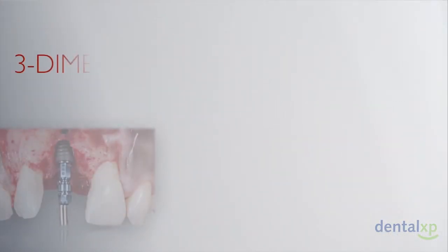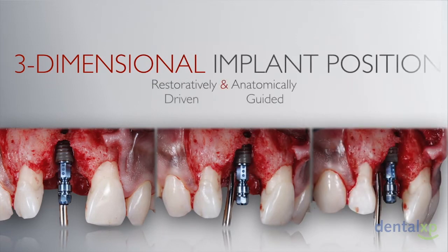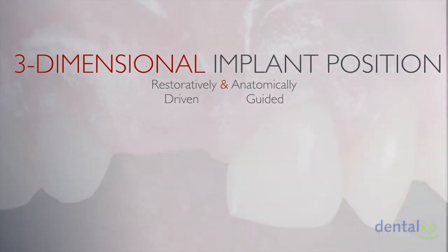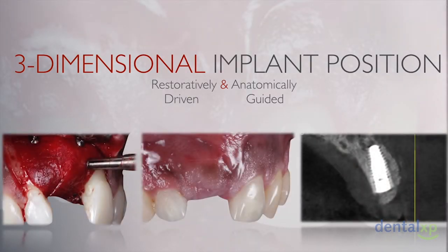So the three-dimensional implant positioning at the end of the day is essentially a balance between the restorative needs for the case and the anatomical limitations at hand. Moreover, the advantage of correct 3D implant placement is facilitating surgical augmentation procedures if needed in order to enhance and maintain the peri-implant tissue contours.